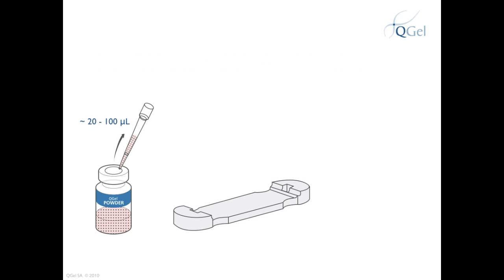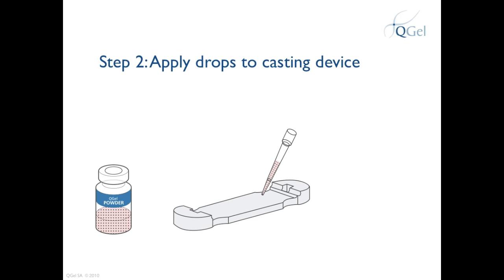Depending on the size of the disk that you want, pipette 20 to 100 microliters of the QGEL cell solution. Apply this drop to the QGEL 3D disk caster.